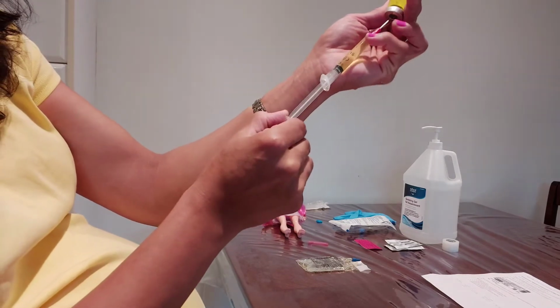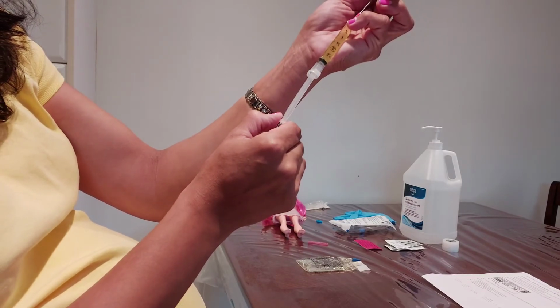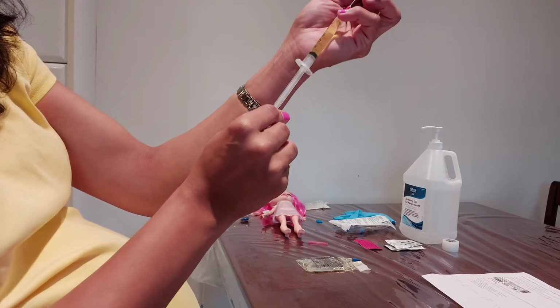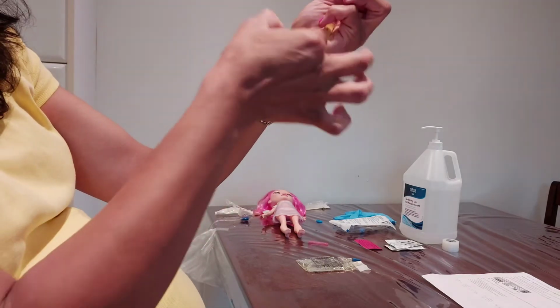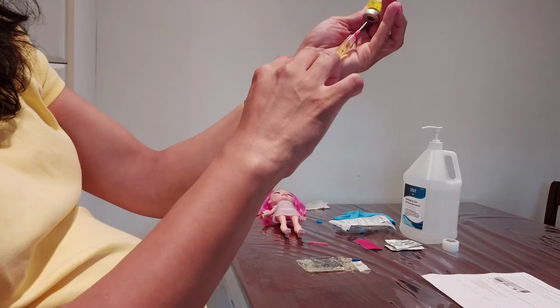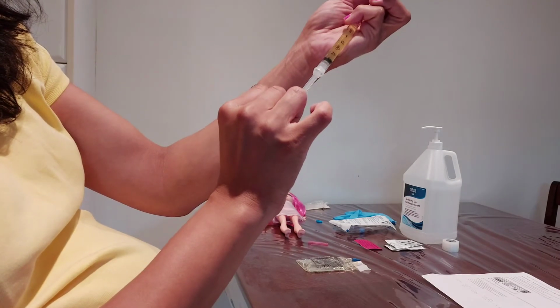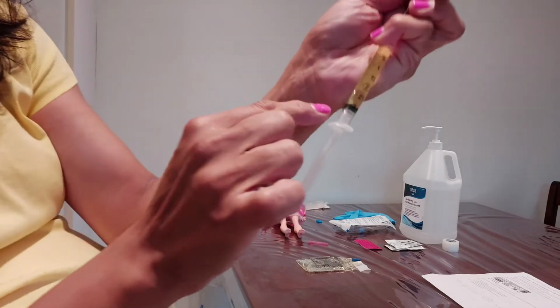Good. Perfect. Yes, it's 3. Now it's 3 milliliters of the medication.